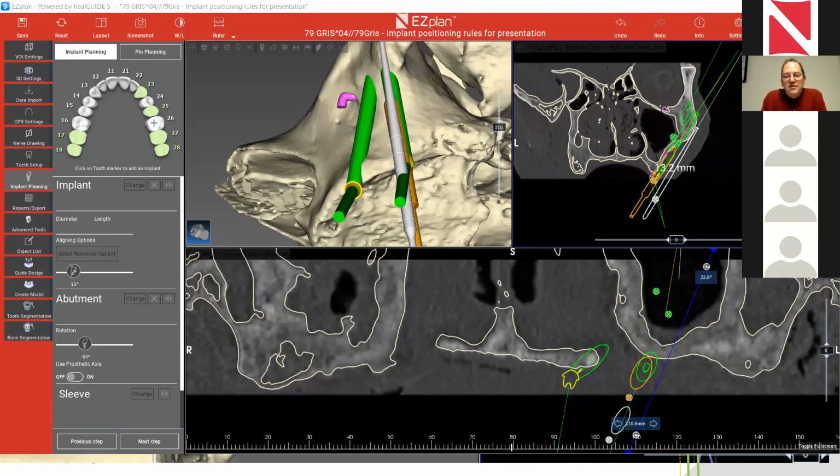Well, that's the trick of the zygoma, because the zygomatic guided surgery that we have gave the solution exactly to this question. I hope you'll be able to visit us and hear the session on Monday. You'll see how it works. Basically we solved this problem. We know today with guided surgery to position implants so the apex will be around 1 to 2 millimeters away from where it was supposed to be on 60 millimeter length implants, and positioning them on the crest within 0.5 millimeters.